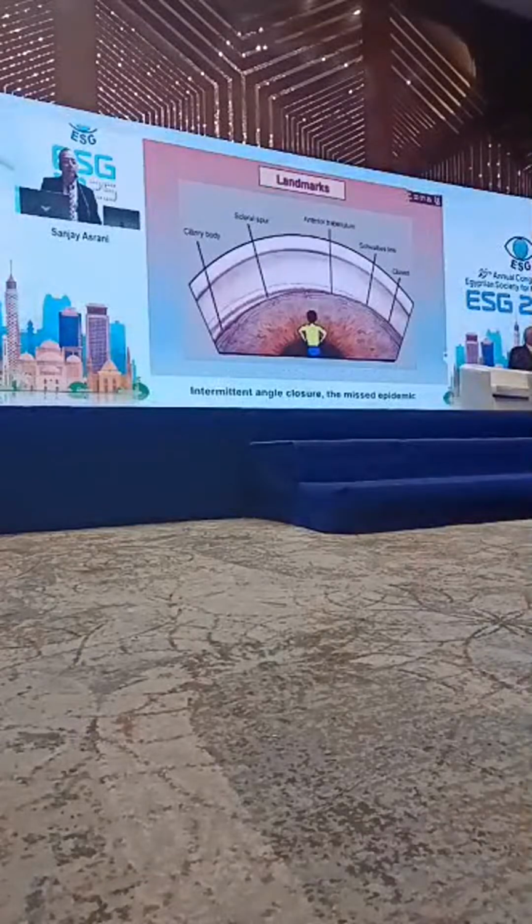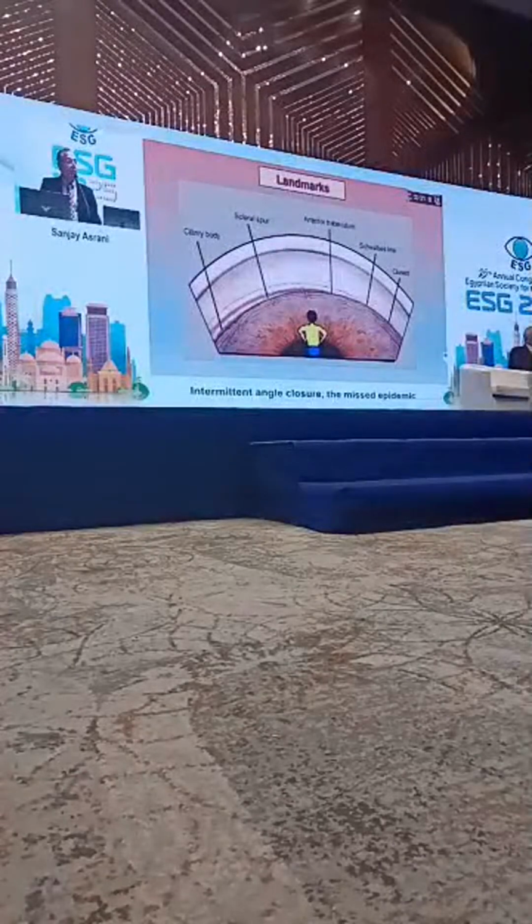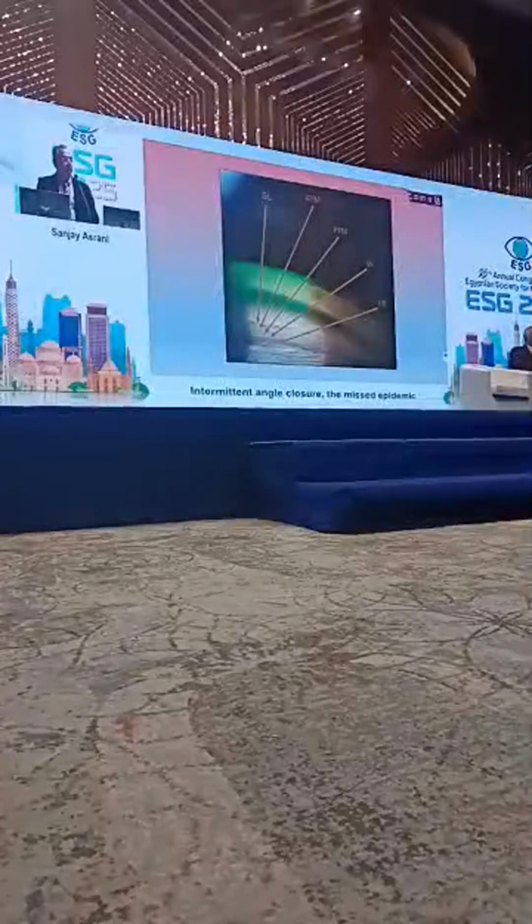These landmarks that we look at, the trabecular meshwork, the scleral spur, the ciliary body, are not easy for us to see. If you look at this picture here, you can see the landmarks, but it is very easy for us to mistake one for the other.